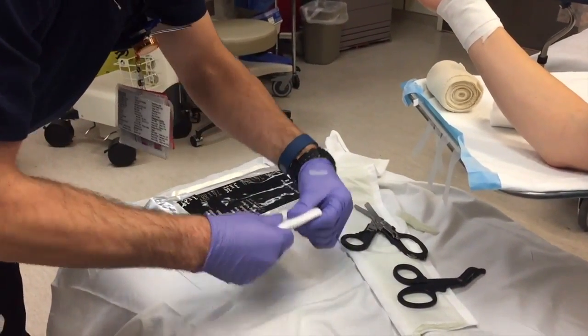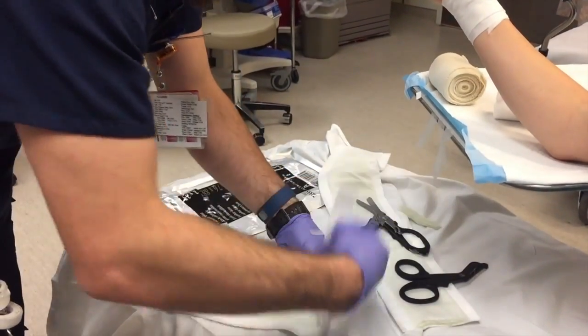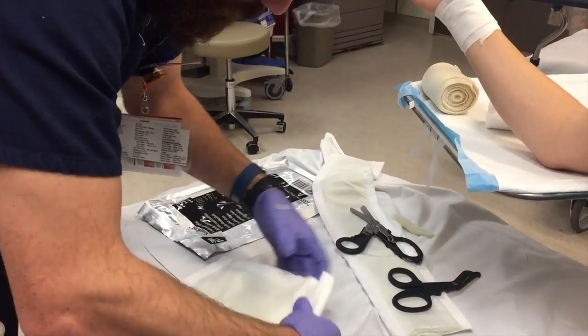I like to pre-tape where I want my folds to be before I get started wrapping. One less thing for me to hold.